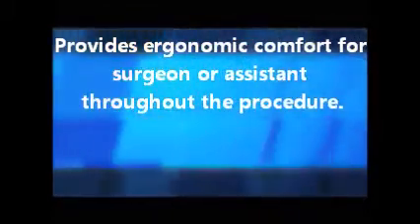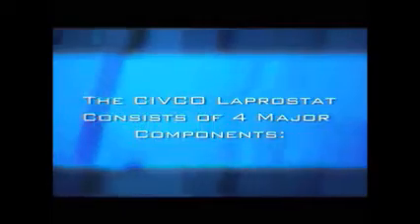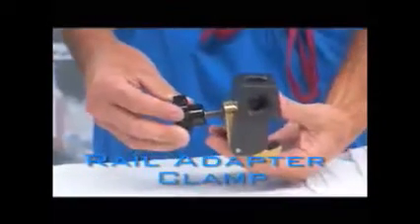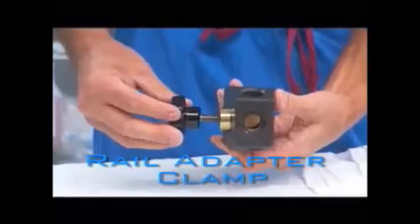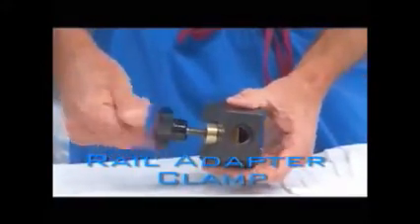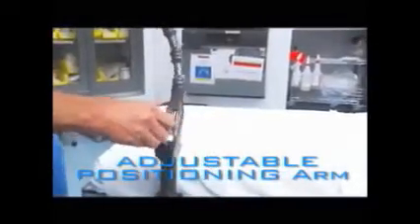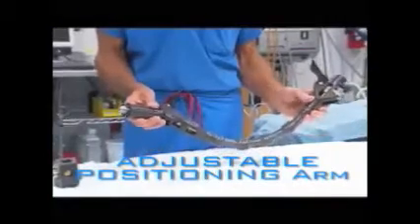The laparostat system is a simple kit with 4 components. The rail adapter clamp securely attaches the system to the surgical table rail, offering 3 mounting positions for the adjustable positioning arm. The adjustable positioning arm has a base able to be angled in any direction and a mobile section easily locked into location.